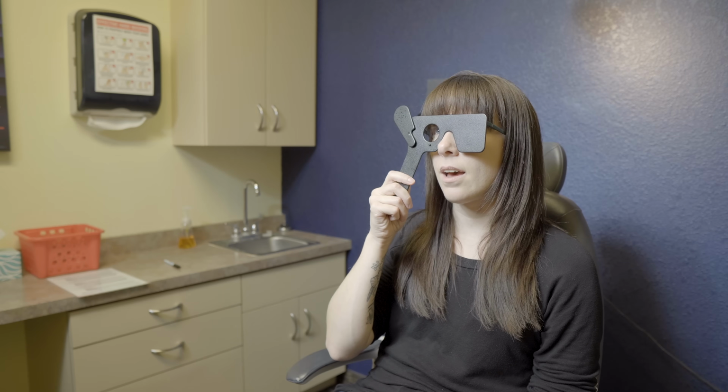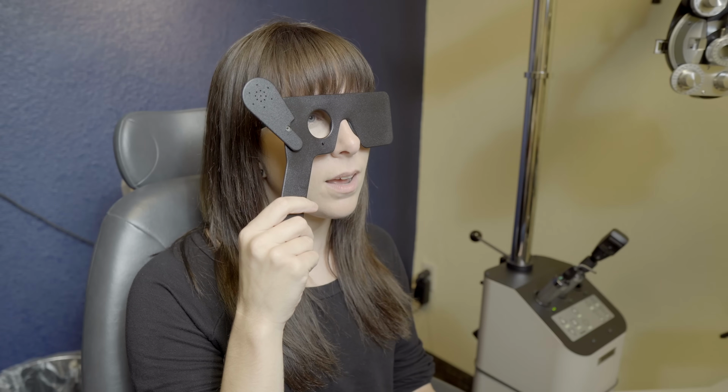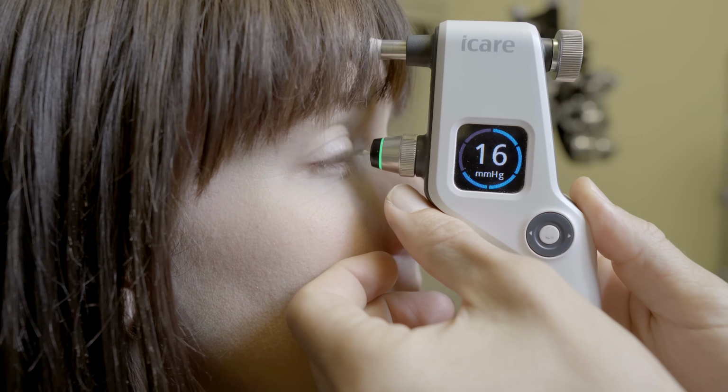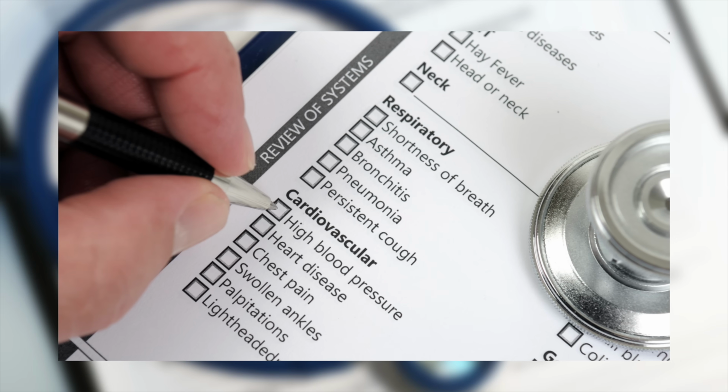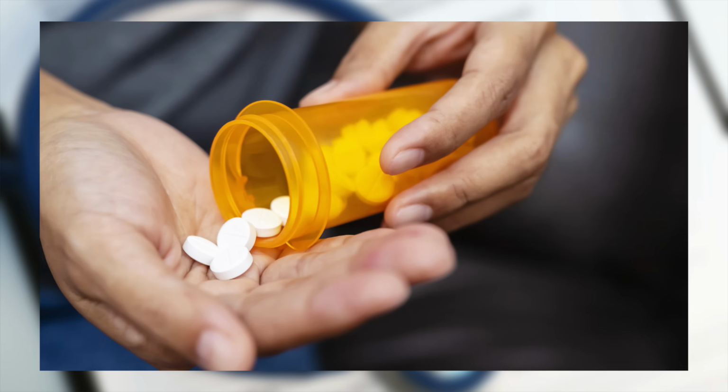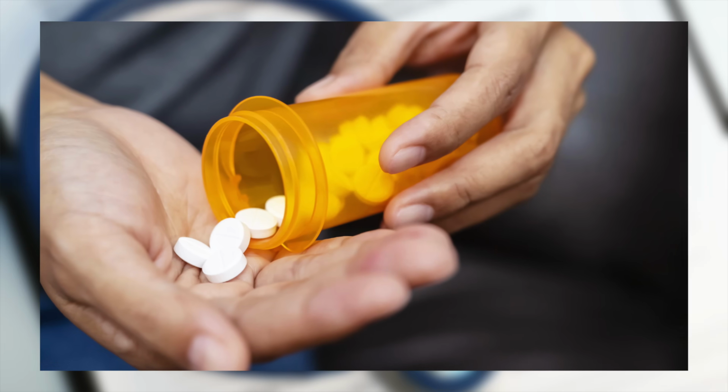So if you were to come into our clinic for a dry eye eval, our technician would first greet you, bring you on back to the exam where they would check your eyesight, your vision, they would make sure that your eye pressures are doing okay, and then they're going to take a thorough history just to make sure that we know what is going on medically, your past medical history, surgeries, any sort of medications that you've been on, and if you have autoimmune disorders, all of those things.